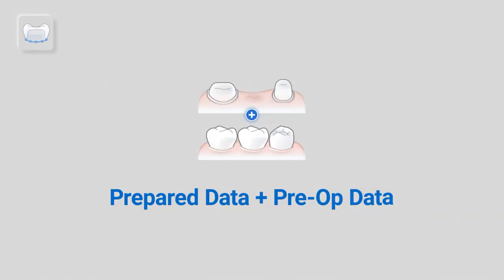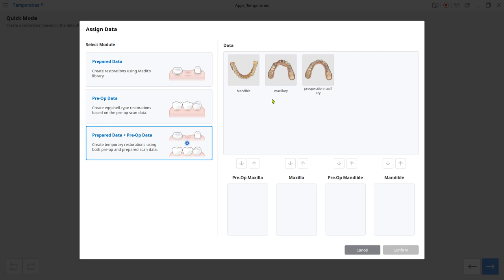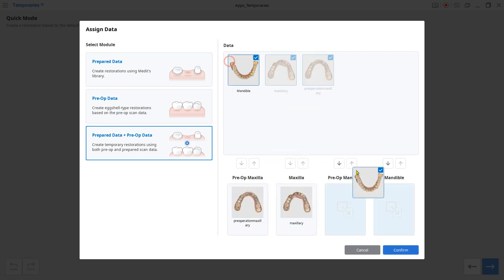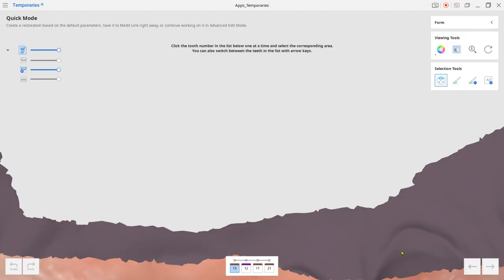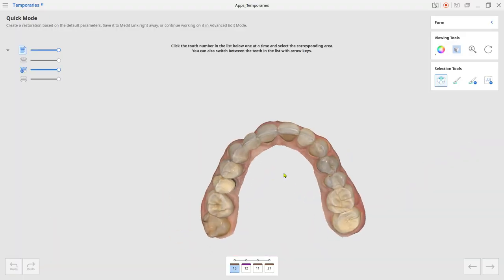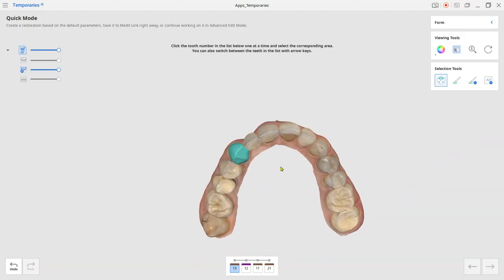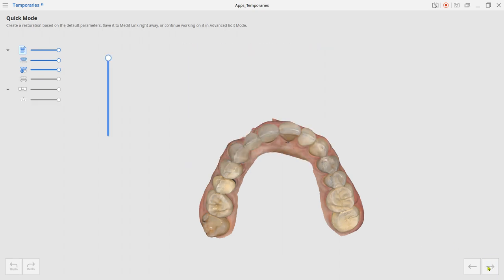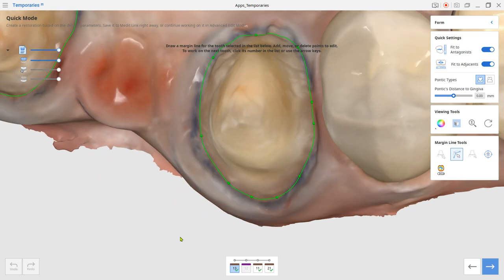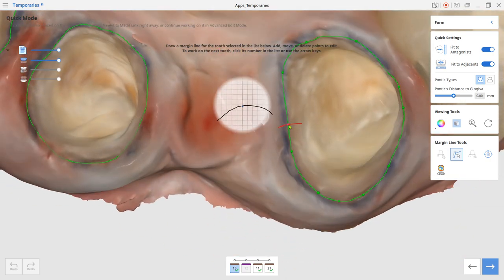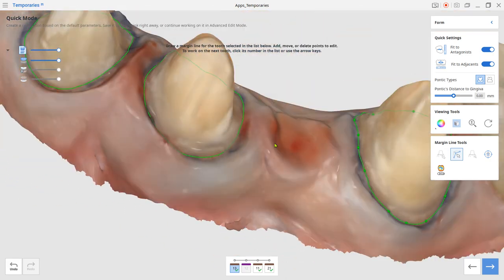Choose prepared data and pre-op data module for margin drawing and place a pre-op temporary crown over it. Click on the tooth number from below and then select the area accordingly. Use the auto creation tool to draw the margin and adjust if needed.